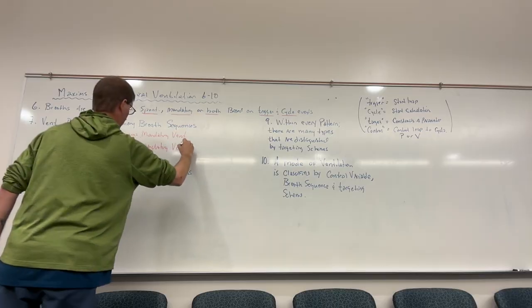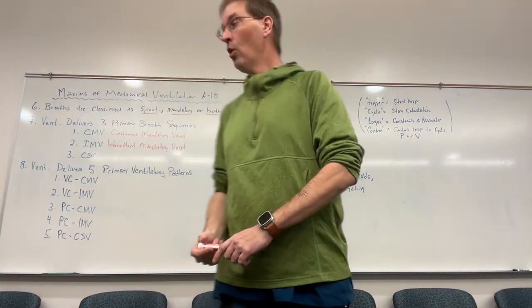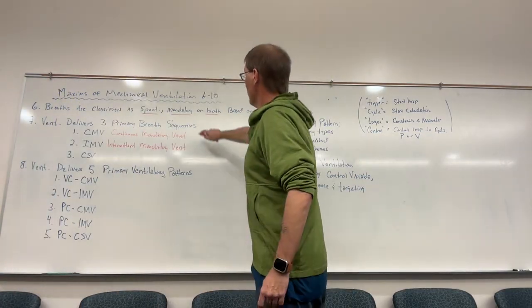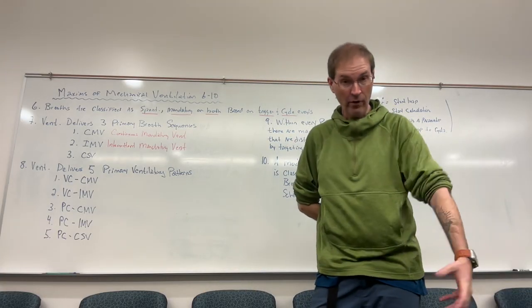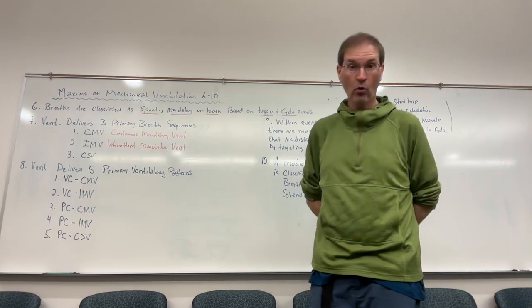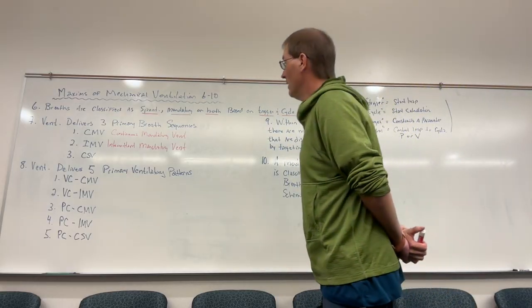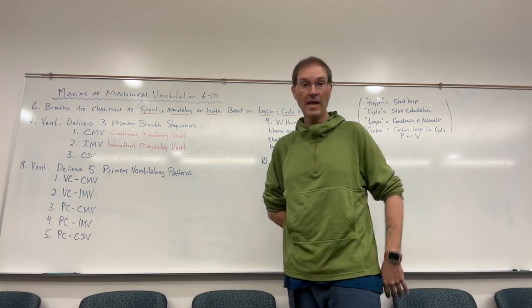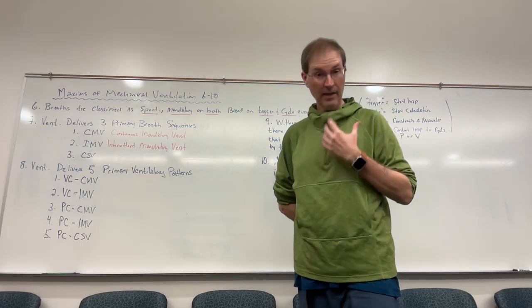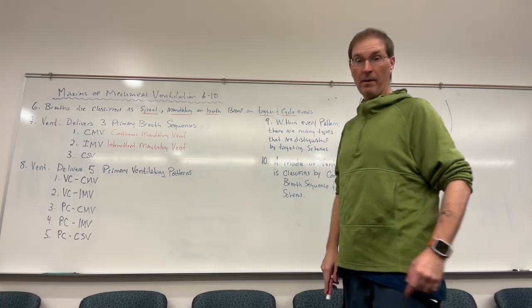All right, intermittent mandatory ventilation, IMV. And intermittent mandatory ventilation is where there is a minimum mandatory setting the patient must receive, maybe a minimum mandatory rate and a minimum mandatory tidal volume, say, if you're in volume control ventilation. And then on top of that, if the patient wants to take additional spontaneous breaths, and remember, a spontaneous breath is a breath that is triggered and cycled by the patient, right?